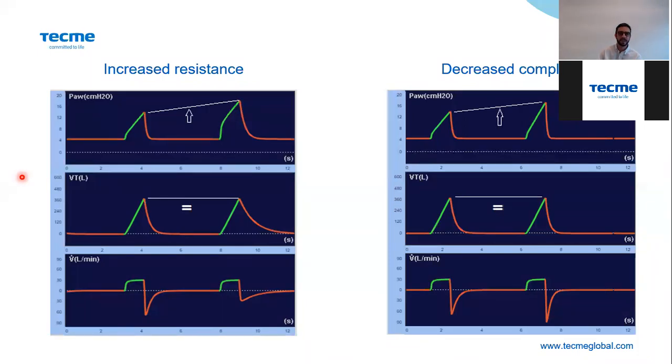And now about the second question, which alarm do you consider the most important? The maximum inspiratory pressure. This is the correct answer. Why? Because here you control the volume, because we are in a volume control mode, but you are not controlling the pressure.